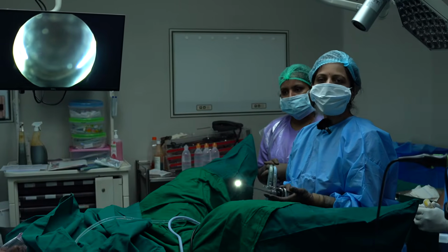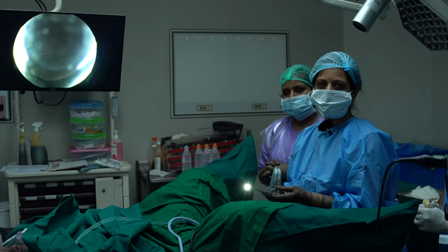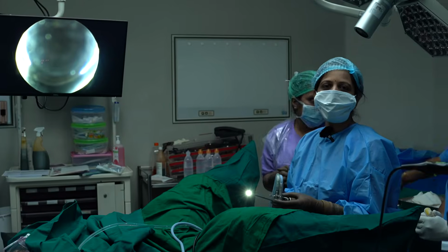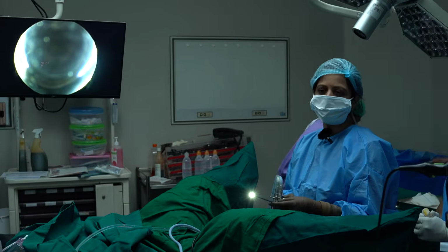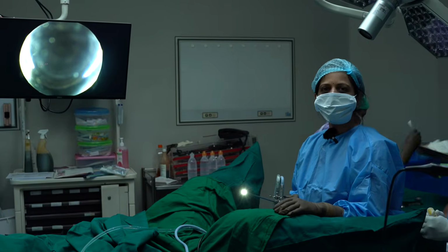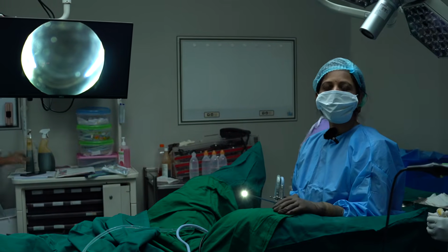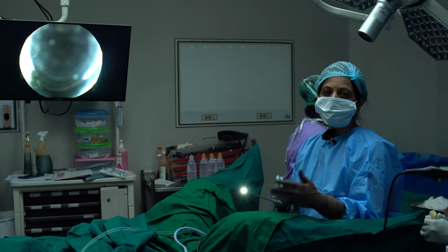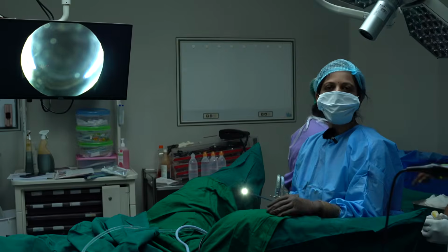If there is any other procedure along with that, like a uterine septum, then we combine the procedure at the same time. But in this case, today it is only a diagnostic hysteroscopy, where we are checking the uterine cavity to see if it is okay for the next FET, that is the next embryo transfer.